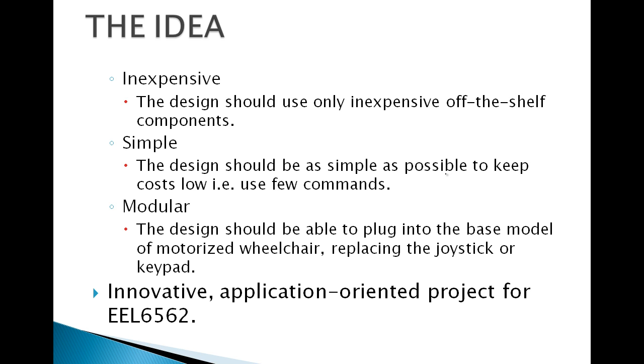So for our design, this means that we use only a few steering commands. It should also be modular, so that the design can be used to swap out the control module of a standard base model motorized wheelchair, replacing the joystick and the keypad. So I feel that this is an innovative and application oriented project that could satisfy the requirements for this course.